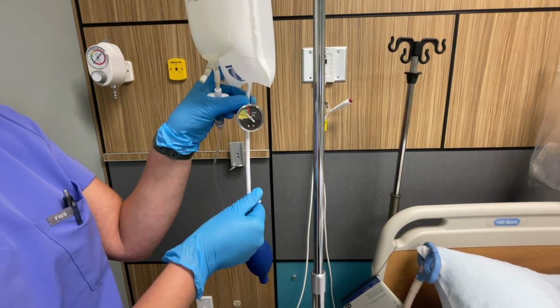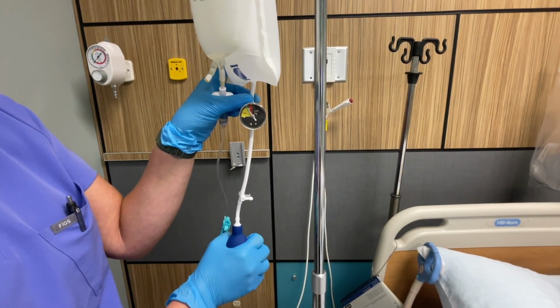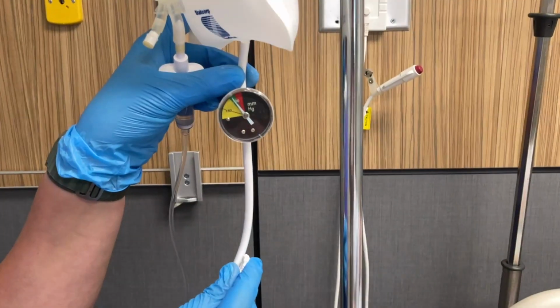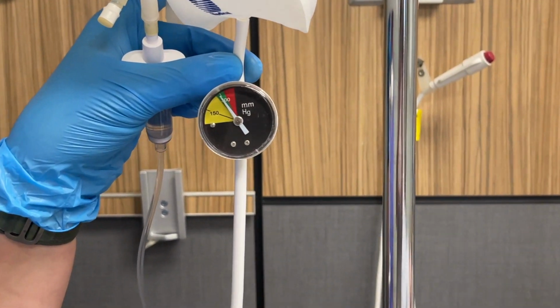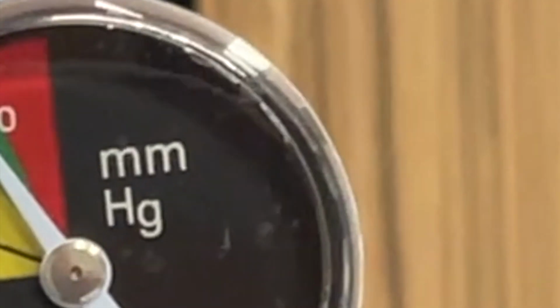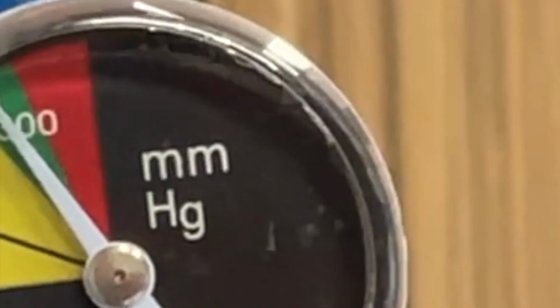You will then use the bulb to squeeze the adequate amount of pressure in until the dial reads in the green. Once the pressure is adequate, you will turn the stopcock into the up position to maintain the pressure. In the event that the pressure indicator is ever in the red area, you will do just the opposite and turn the stopcock down towards the bulb, releasing excess air.